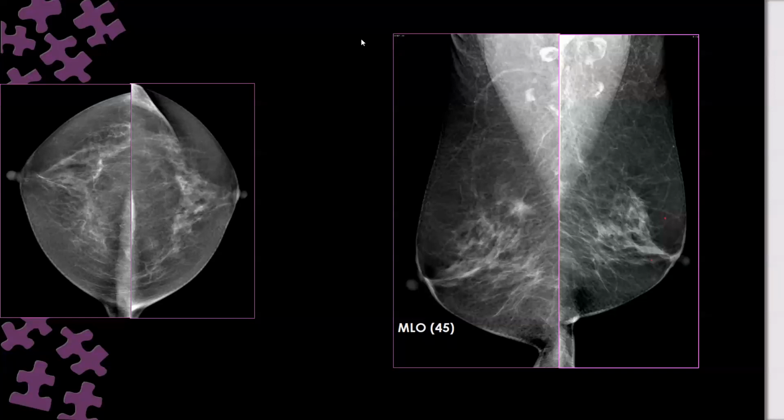Yes. For views, it showed a spiculated mass in the right MLO. Fatima. Yeah. We said if we have seen the opacity in a single view, we will not call it a mass until we could see it in two views.